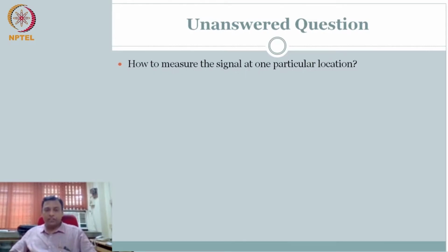Can I change the Larmor frequency? Well, the Larmor frequency for hydrogen is unique. However, it is a function of Tesla, or the field strength. What happens if I change my field strength at different locations? Different locations will have different frequencies. So if I know how they are distributed, if I manipulate the magnetic field at different locations, then I also know where the frequency is coming from.